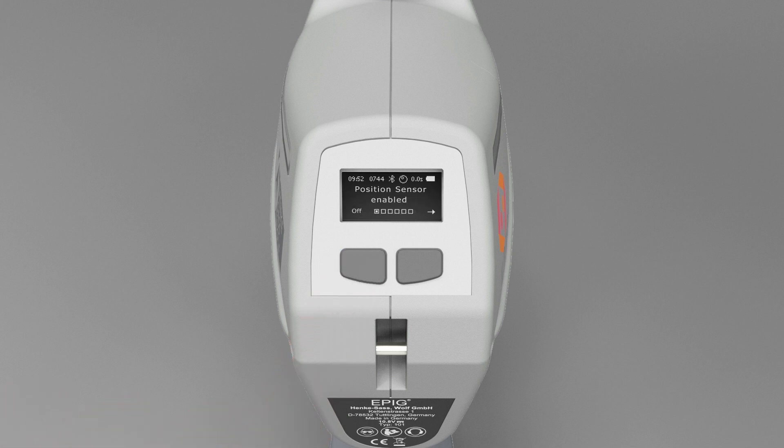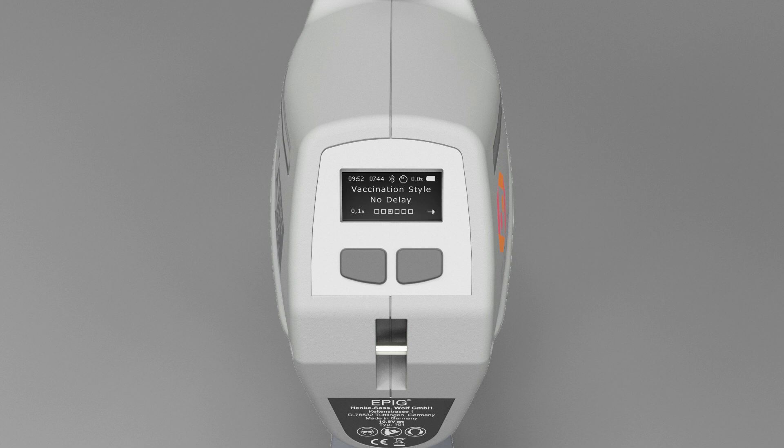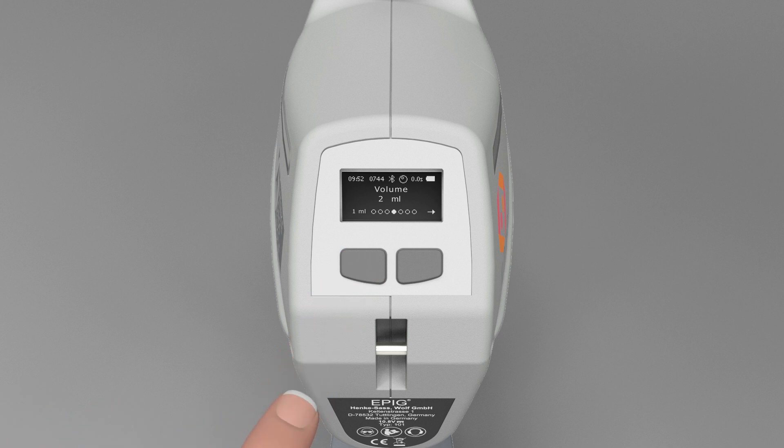The second level contains settings that only need to be changed infrequently and that particularly affect the sensor technology of the device. In both levels, move through the menu by pressing the right display button. Change or reset the respective presets with the left display button.